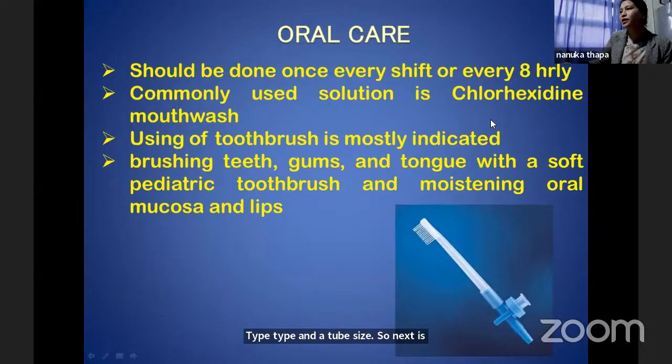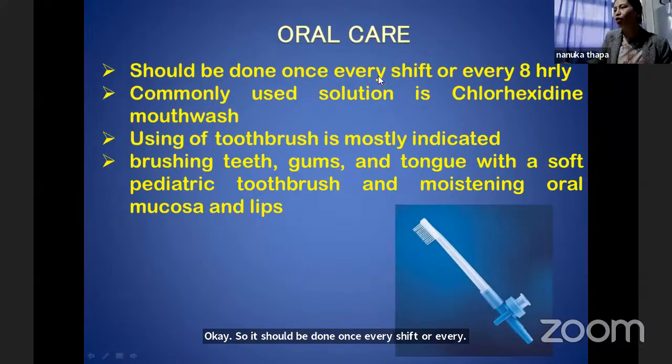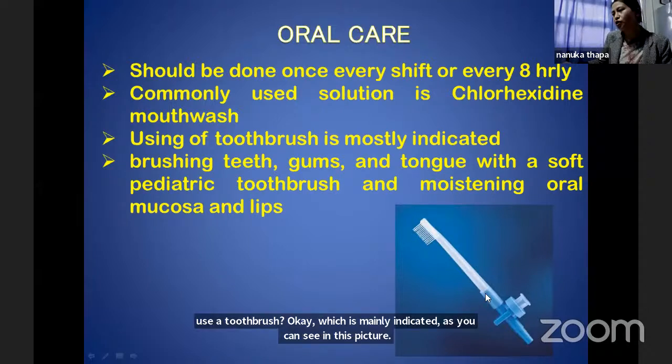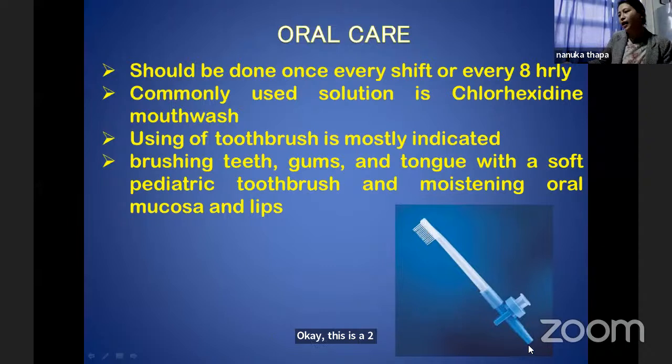Oral care should be done once every shift, or every 8 hourly. So you can do morning time, evening time and night shift, okay? The commonly used solution is chlorhexidine mouthwash. Nowadays we mainly use a toothbrush, as you can see in this picture. This is a toothbrush used for oral care of an intubated patient, and we can connect the end to a suction machine. Through this top end, there is a hole.